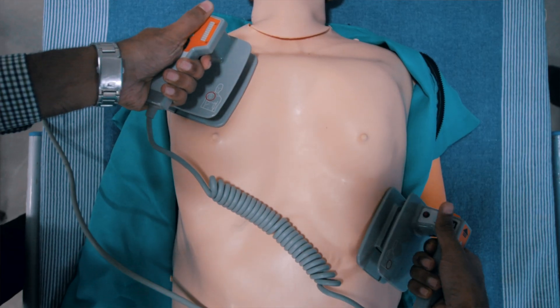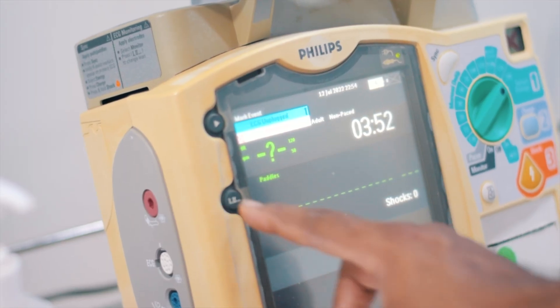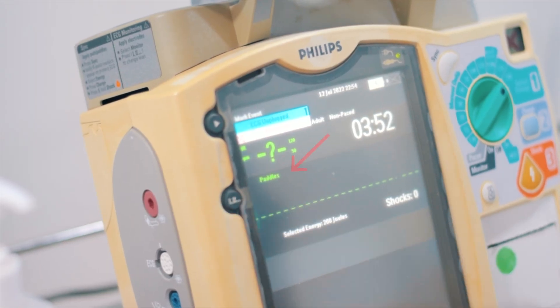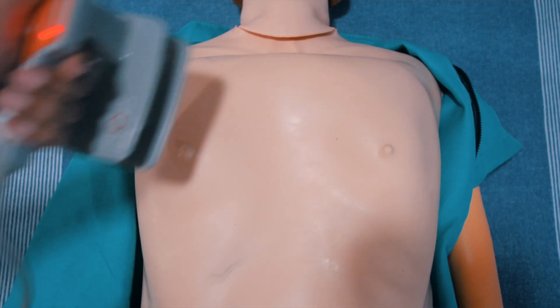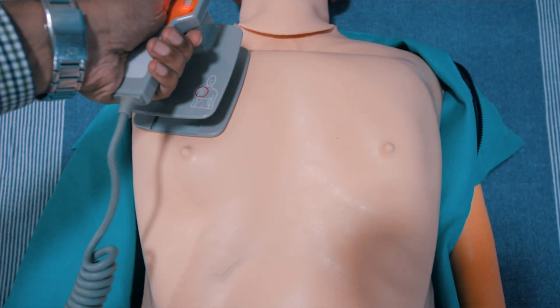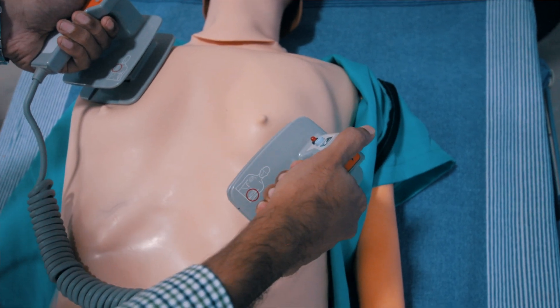If you're using the external paddles, you have to select paddles from the rhythm monitoring settings and place the sternal paddle over the right side of the sternum and the other paddle over the apex.